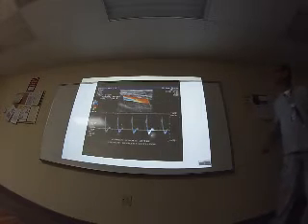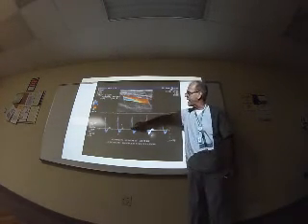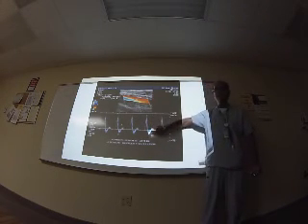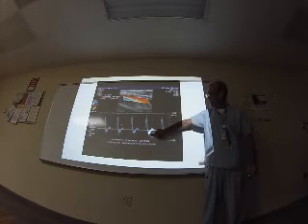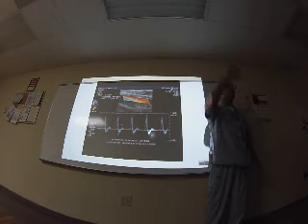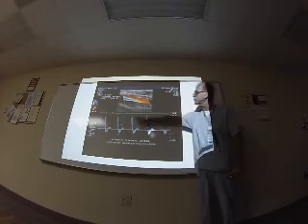Color Doppler. You can see here a combination, color Doppler and spectral Doppler. The shape of the wave is triphasic, positive, negative, and another time positive. This is the normal artery. When the artery is working well, it is multiphasic or triphasic.